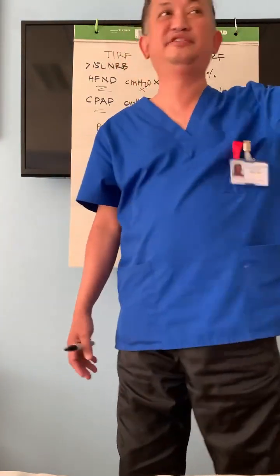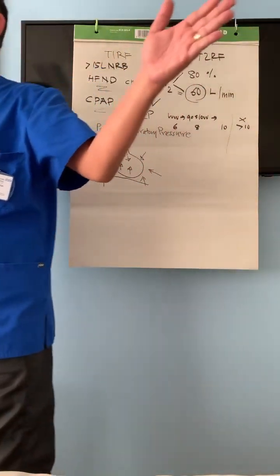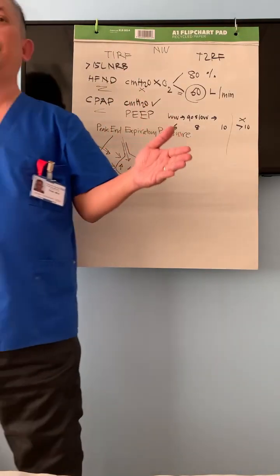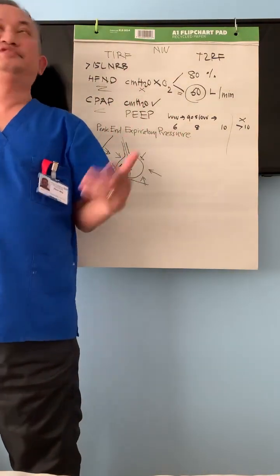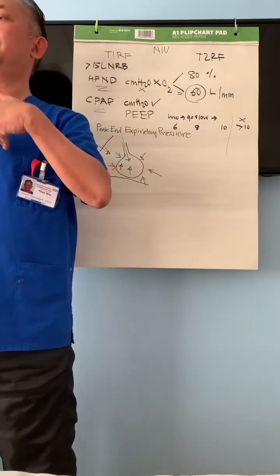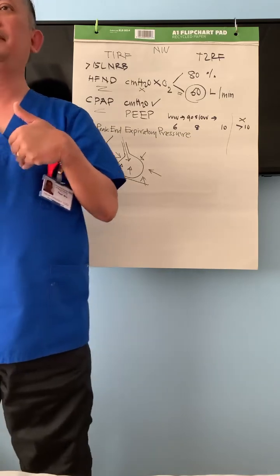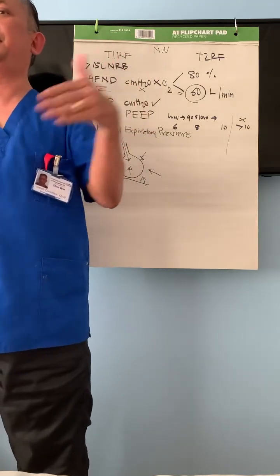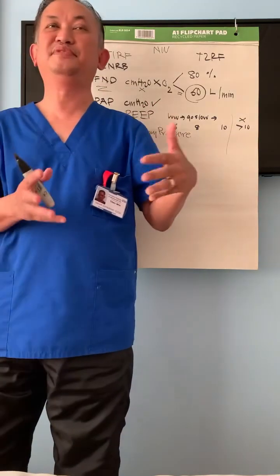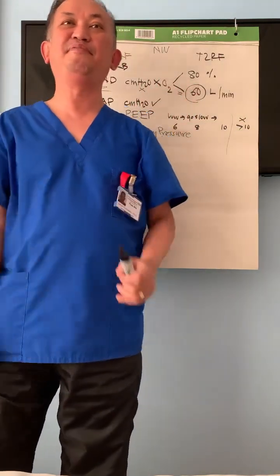The air goes along with the stream of the flow. They won't complain about the inspiration, because while they inspire, CPAP is blowing in, it doesn't matter. The air is flowing alongside the breathing effort. But at the time of expiration, if you increase CPAP pressure too much, it is pushing the air not to come out while breathing out.